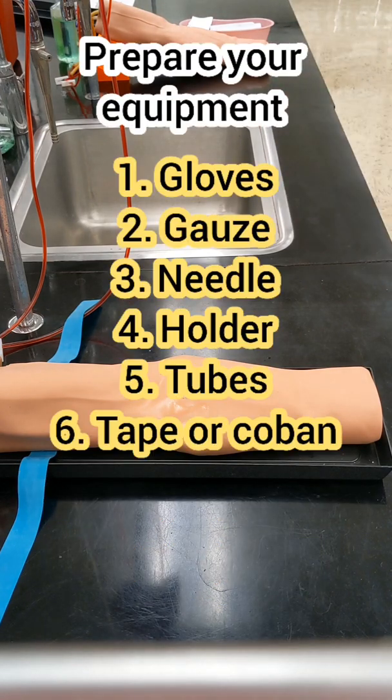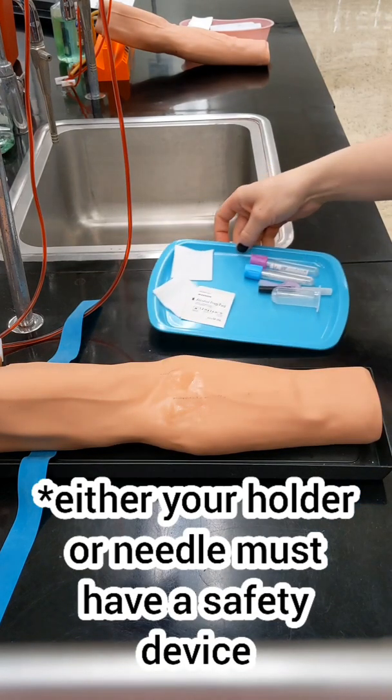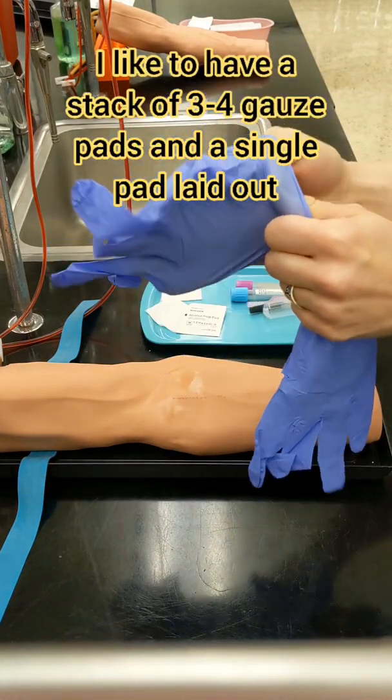While your patient is drying, go ahead and prepare your equipment. Get your gloves, gauze, needle, holder, tubes, tape, or co-band. Your holder or your needle need to have a safety device, and make sure you have a sharps container nearby.